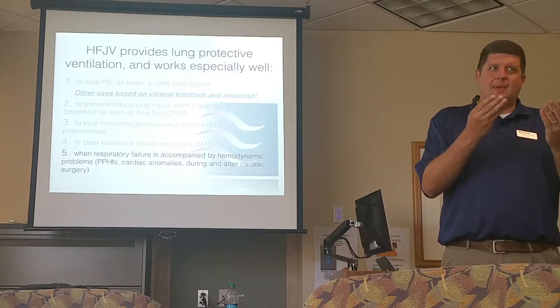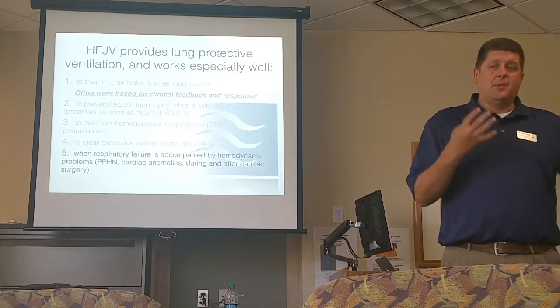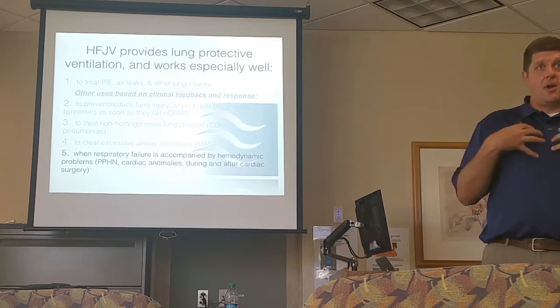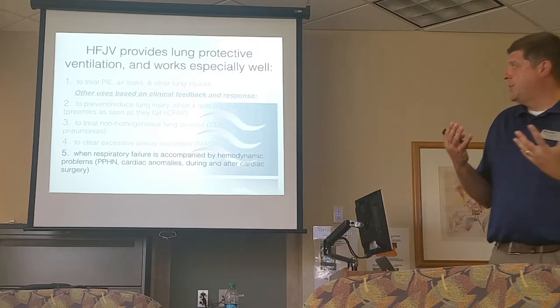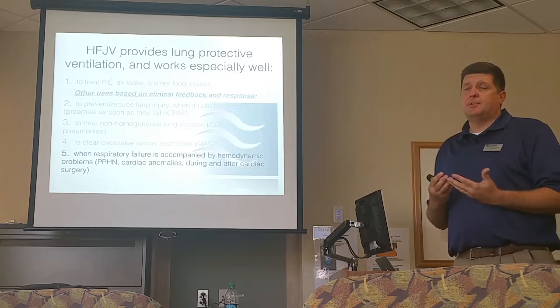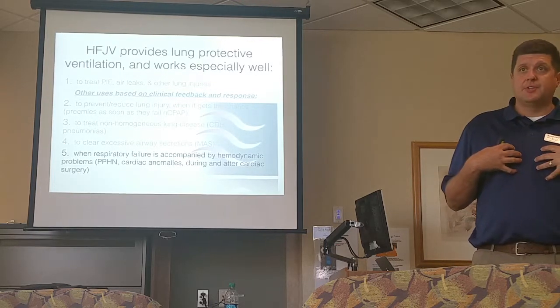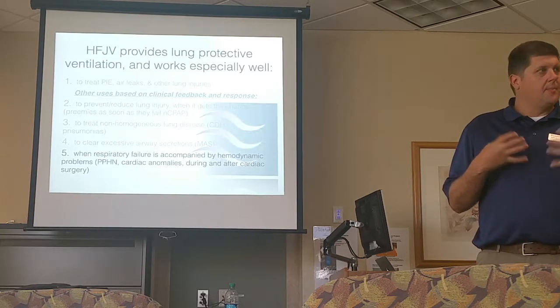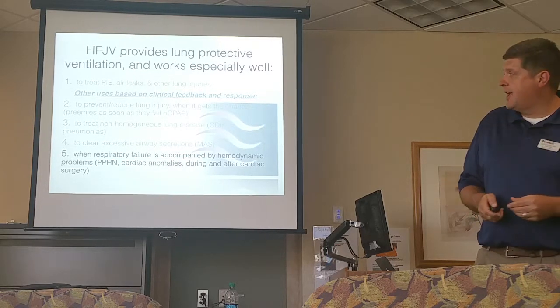We start increasing mean, and we increase mean a little bit more, and we're cranking up the FiO2. And then we start to develop this hemodynamic compromise with the higher intrathoracic mean airway pressures. And because the jet's able to get good gas exchange at lower overall mean airway pressures, if we can reduce that hemodynamic compromise and help VQ matching, it can certainly help.